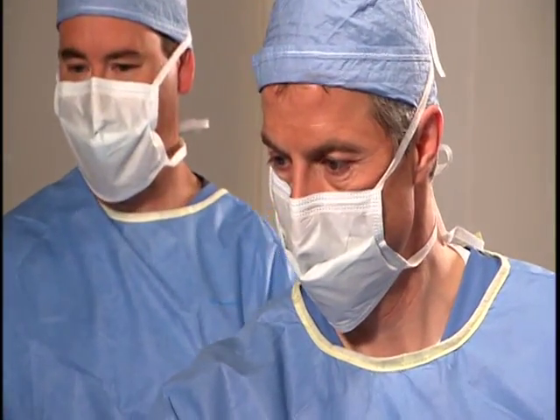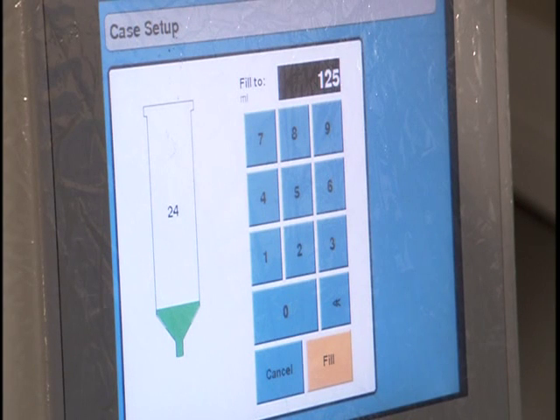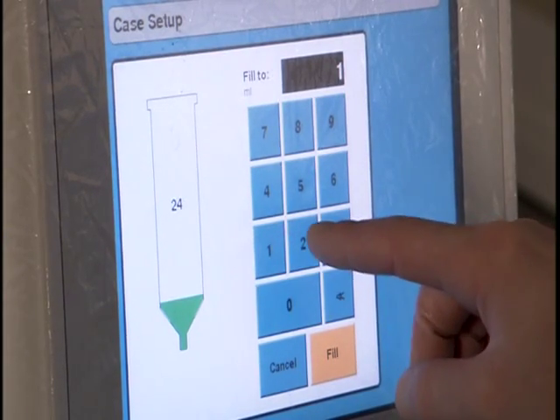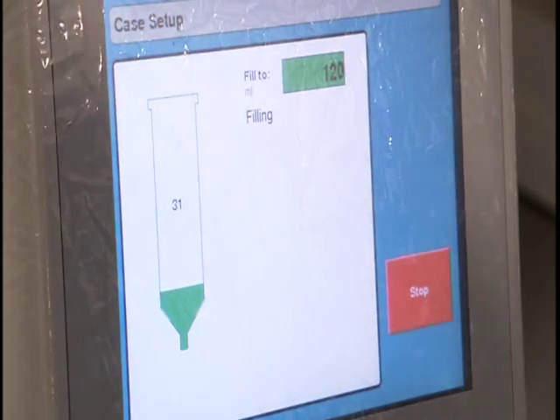Manual fill can be initiated when the system is disarmed. Select Setup on the main screen and touch Fill Syringe. The DCU displays a graphical representation of the volume in the syringe. Then enter the desired Fill To volume and touch Fill. When the syringe has filled to the programmed amount, it will automatically stop.